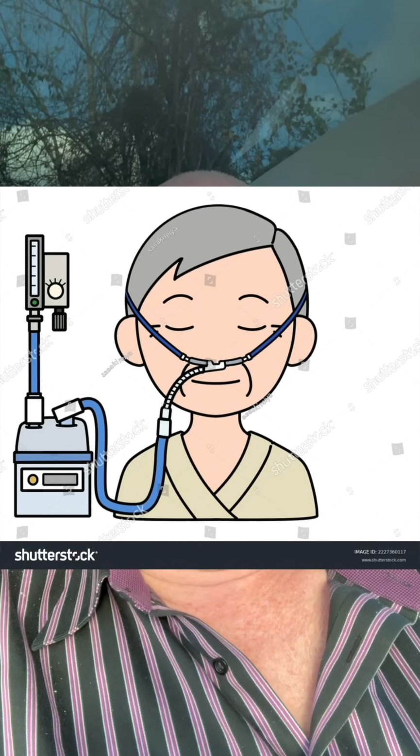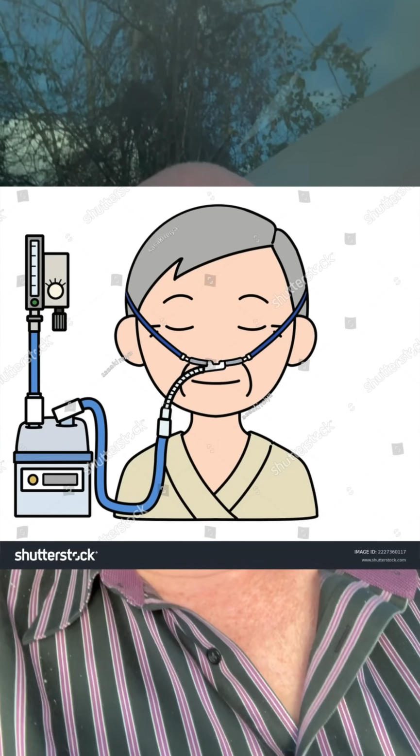The other problem is you really just don't know what the FiO2 is with a standard nasal cannula. When the liter flow requirements for hypoxemia treatment exceed 5 or 6 liters per minute, you're better off using one of the high-flow nasal cannula systems where you can at least set the FiO2 and you can add some heated humidity for comfort. People talk about the heated high flow as if the heat is the therapeutic part. The heat and the humidity is mainly to avoid complications. It doesn't make the oxygen work any better. It's the high flow that leads to the better oxygenation.